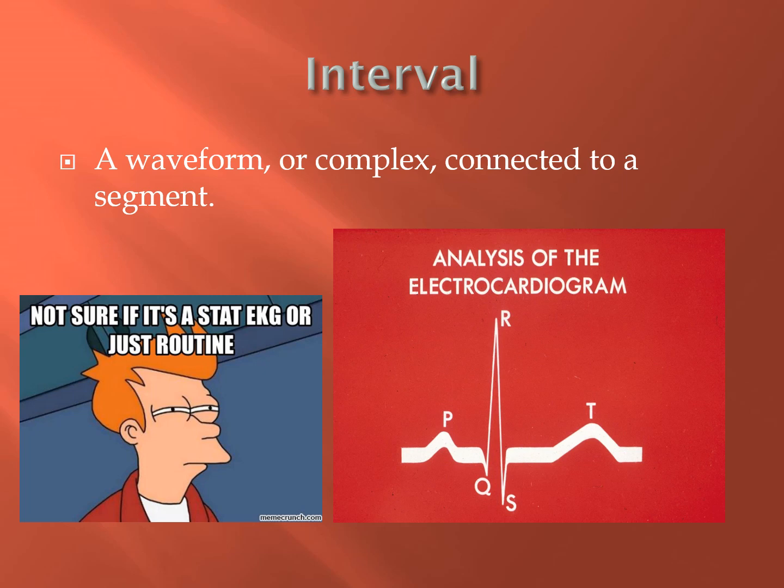We're connecting a waveform or a complex to a segment. Well, the segment is that point or flat time in there. So it's how long it took to get from the P wave to the R wave if we're looking at the PR interval. That's a good example of an interval, would be the PR or the QT.